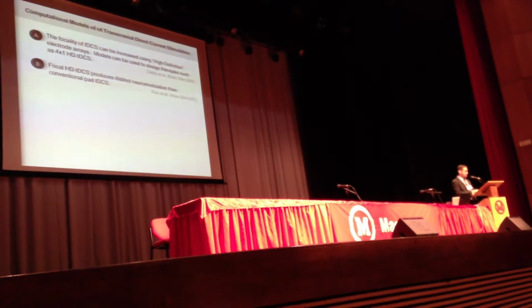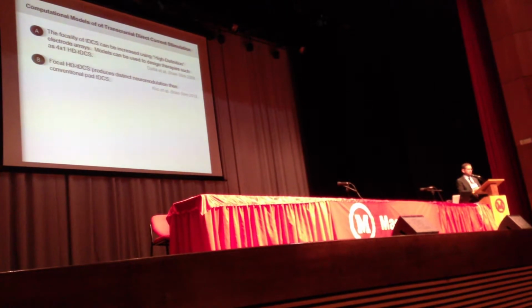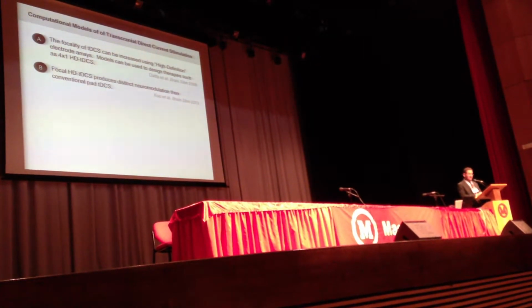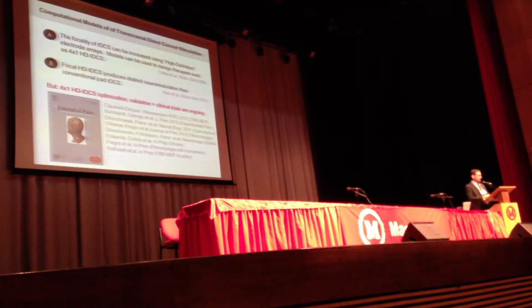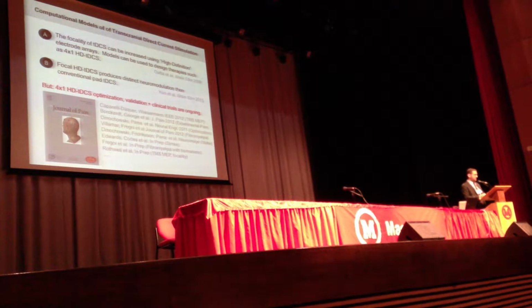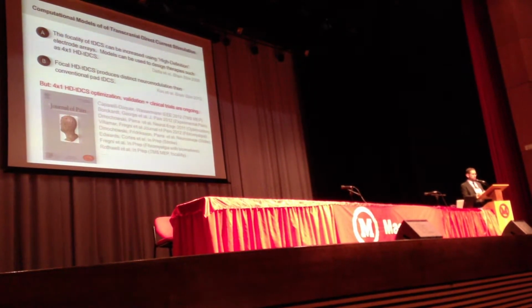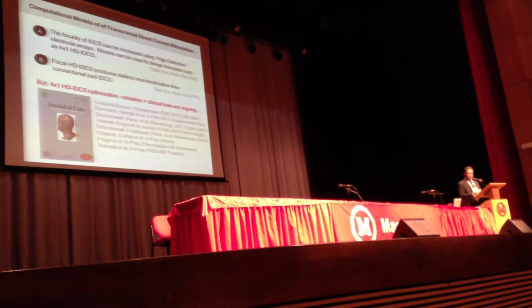And so this paper, which is really foundational for high-definition tDCS, established that focal modulation with DC current can produce lasting plastic changes in brain function, in this case that lasted for a significant bit of time. Now certainly this is just the beginning, and there are several ongoing clinical trials, human neurophysiology trials, looking at this technique, looking at dose response, and so on. But I am increasingly confident that the predictions being made by the models are relatively correct, as they've been borne out in all the tests that have been run.